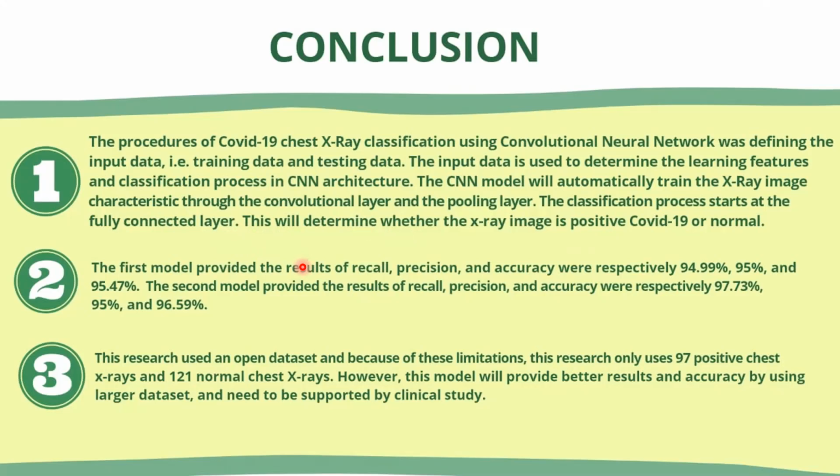and this will determine whether the X-ray image is positive COVID-19 or normal. The second conclusion, the first model provided recall, precision, and accuracy of respectively 94.99%, 95%, and 95.47%. And the second model provided recall, precision, and accuracy of respectively 97.73%, 95%, and 96.59%.